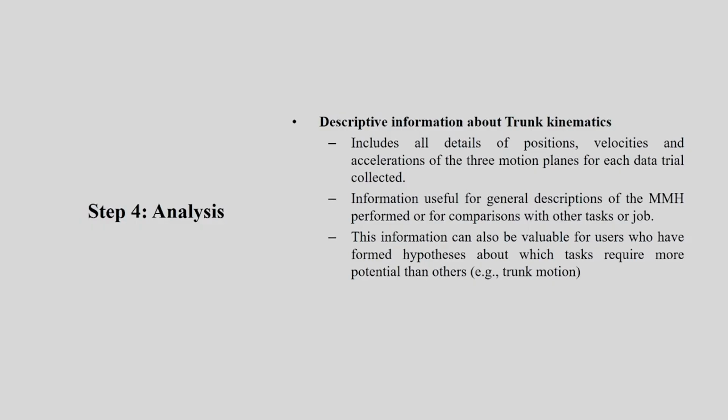So the descriptive information includes all the details of positions, velocities, and accelerations of the 3 planes for each data trial collected. So for each data you have all this information. That's why I said a lot of data points.